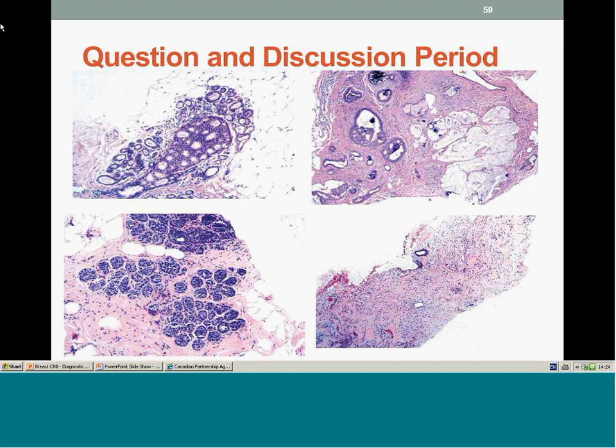You sort of see a little bit of Indian filing, and the only reason I do that is because I prefer, if possible, to classify it as ductal or lobular. But in some instances, if I don't think I can get the immunos back in time and I need to get the case signed out, I'll just sign it as invasive mammary carcinoma and say that the permanent, or rather the excision, will be used for the definitive assessment.